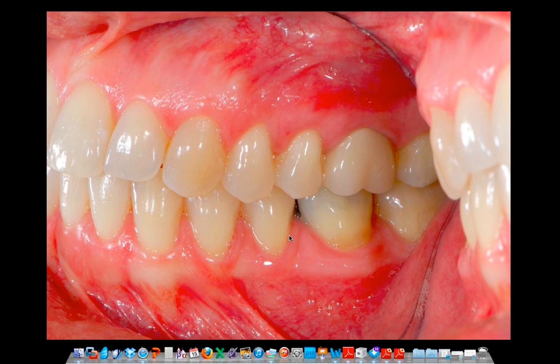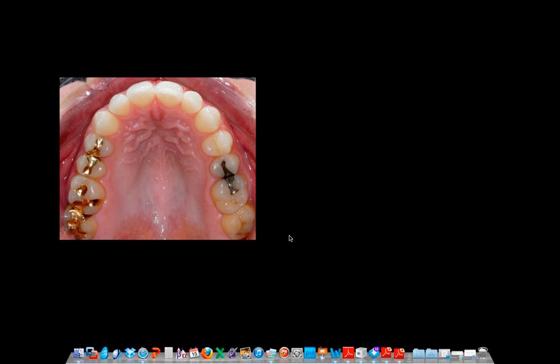That's your indicator that you really didn't stretch them enough, or you didn't move your retractor on the other side to the midline, or you used too big of a lateral mirror. And believe it or not, I use the big lateral mirror, the large one, for most of my shots. I'll go to a medium one for most adults when I can't fit the large because I love getting the soft tissue. But the little one, which is tiny, you'd think is only good for pedo, which it is, but the little one is actually really good for smaller mouths. So again, I have three sizes because all three sizes are used by me on a regular basis.